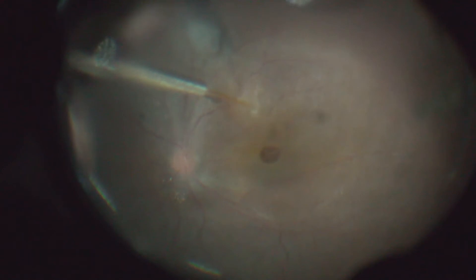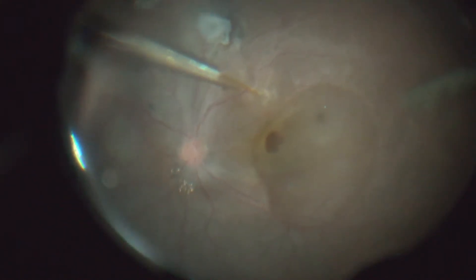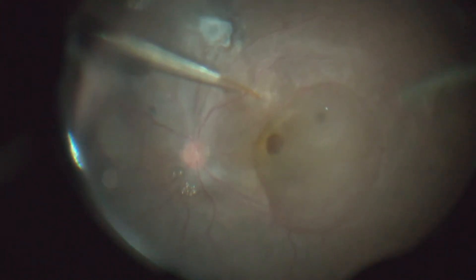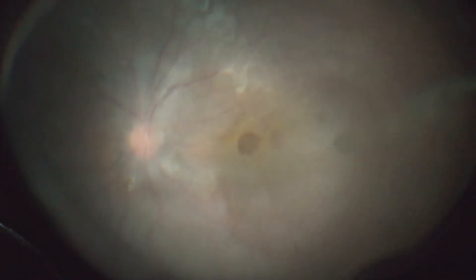Here I'm injecting under the superior macula and I notice that the sub-retinal PFCL bubble is dislodging a little temporally, so I decided to inject more hoping for total displacement of this sub-retinal PFCL bubble. And here we go — the bubble is away from the fovea and is moving freely under the retina.